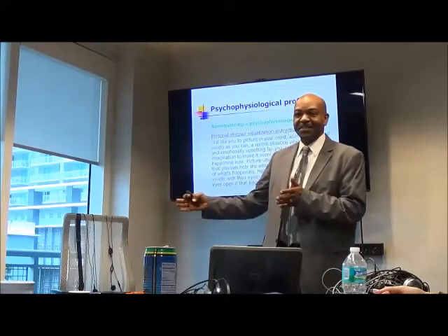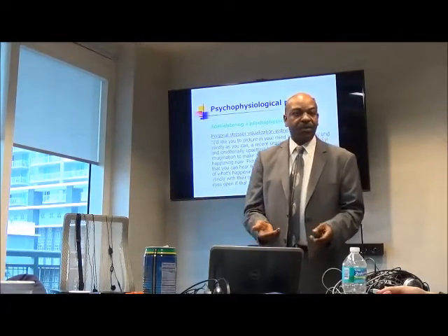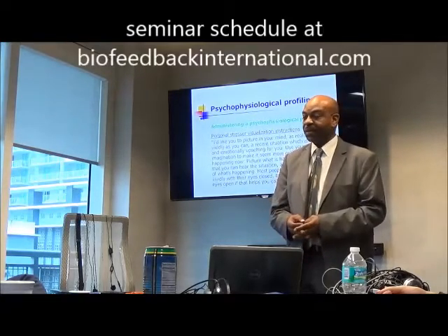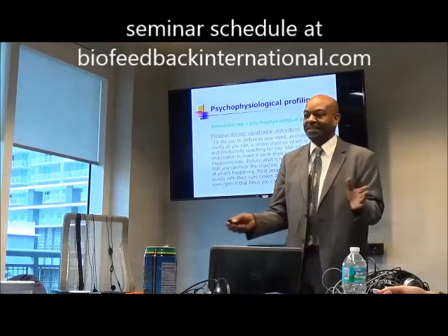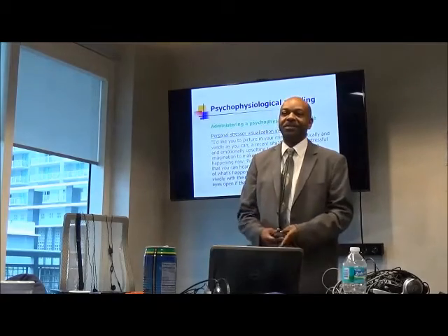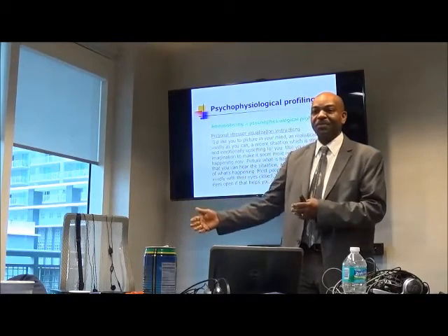And then the rest of the time you still need them to keep talking, so you may have to ask them to elaborate on it. So for instance, when I was working with people that were in car accidents, I was asking them about the car accident. Tell me, describe the car accident that you were in. So some people, they said, well, I was at a red light and a car hit me from the back. And they just stop. So I say, okay, so after they hit you, what happened? You know, did you stay in the car? Did you get out? Were you hurt? So then they start talking again, and then you just wait until the time is finished.